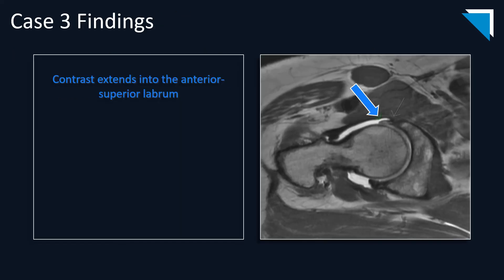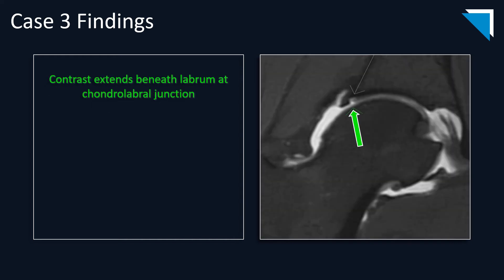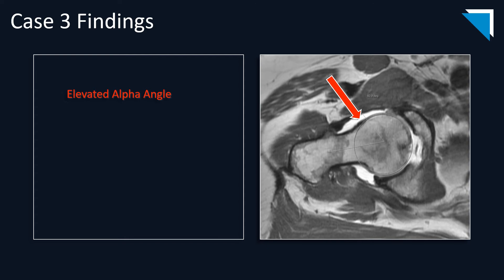Case three is a patient who came in with right-sided hip pain. On this coronal image, there is contrast extending into an enlarged and somewhat globular anterior labrum. On the sagittal T1 fat-saturated image, contrast extends into the anterior superior labrum. On the coronal small field-of-view T1 fat-saturated image, contrast extends deep to the labrum at the chondrolabral junction, indicating labral detachment. A cortical bump within the anterior lateral femoral head — a pistol grip deformity — is also present, with an elevated alpha angle of 61 degrees.